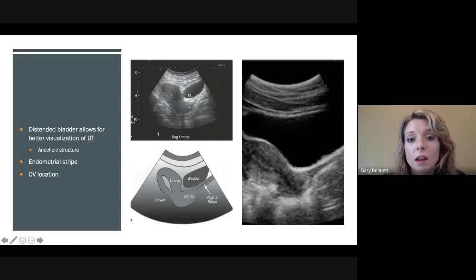Now transitioning into the ultrasound image itself, just above that caricature essentially, we have again the dark color, the anechoic bladder structure here labeled BL. This is a transabdominal sagittal uterus image. We can see that nice uterus lying behind that right here. You can see the myometrium we're able to appreciate, and then this thinner, lighter color, that's the endometrium right there. So this is just a regular pelvis, not a pregnant patient, or at least not very far along. But again, just to help orient ourselves.